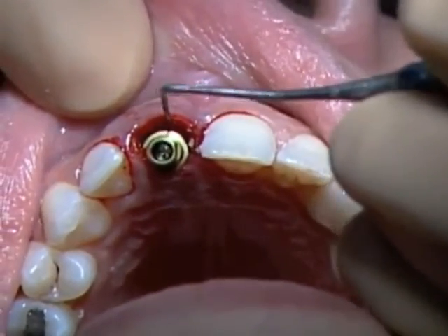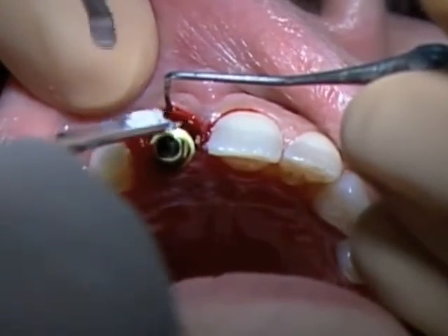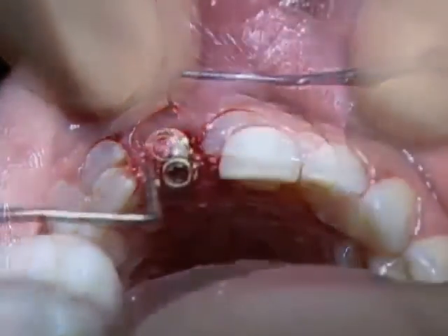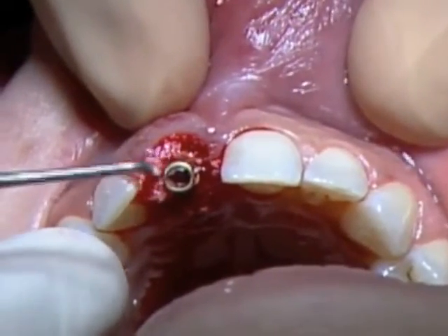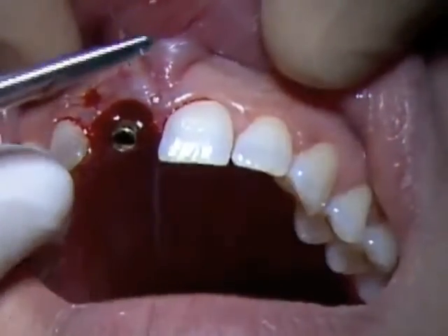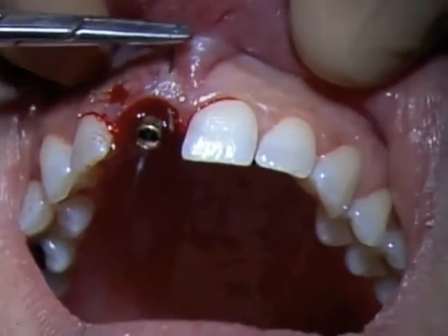We see here the membrane placed. My assistant will hold it in place, and I will start augmenting the area with a non-resorbable or very slow resorbable bone substitute material. We will use at the end our probe in order to make sure that we pack well the bone substitute material and that it runs all the way in between the implant body and the buccal plate. Once we have completed, we proceed with the sutures.